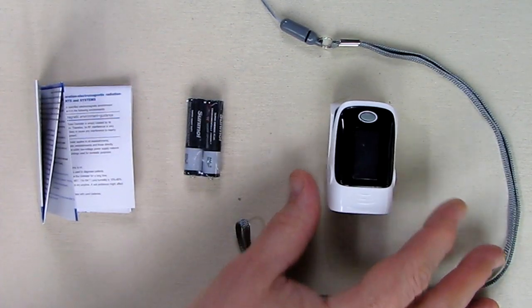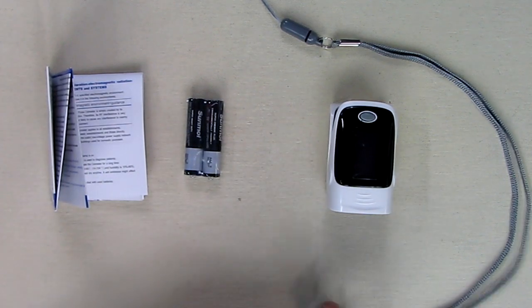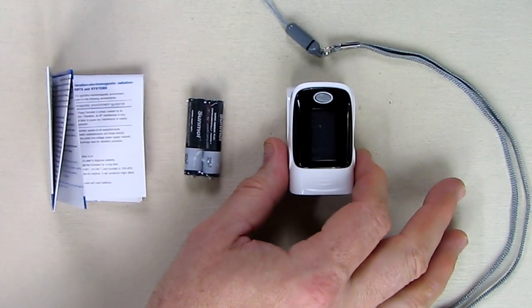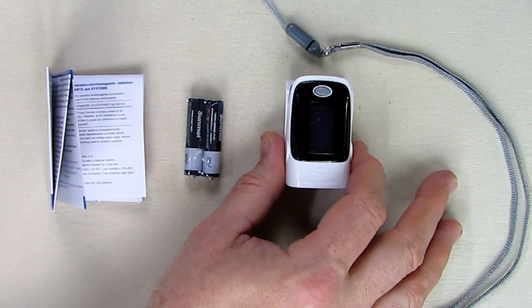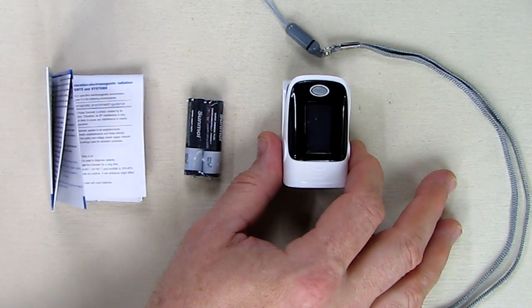This is the unit itself right here. It comes with a little instruction sheet and a nice little holder that you could loop on the little holes right there. This will show the percentage of how much hemoglobin is in your blood that is carrying oxygen. It also shows your pulse intensity in a bar graph display, your beats per minute, and a pulse wave display showing the strength of your pulse in waveform — all in color.